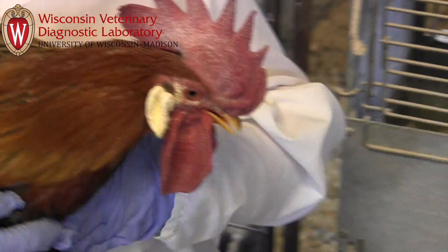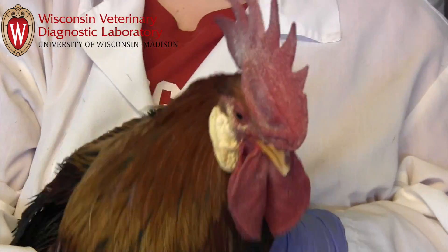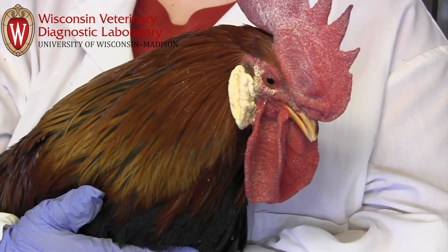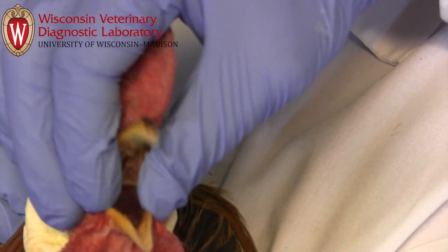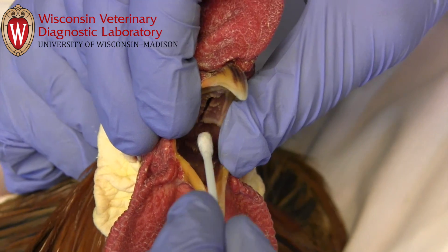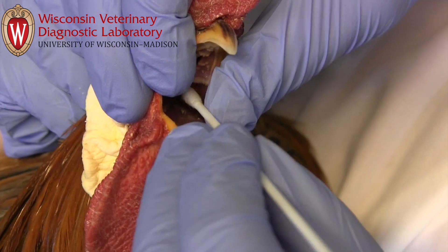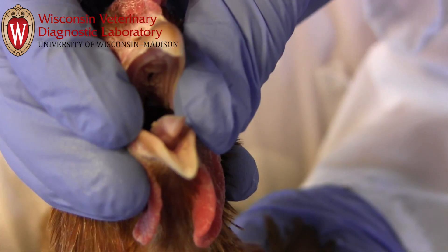Handle the birds confidently and calmly to prevent unnecessary stress. If the bird vigorously resists, give it a break while keeping it secure in the holder's arms until you attempt again. Open the mouth with gentle but firm pressure at the corners of the beak. Having a finger in the angle of the beak will keep the mouth open as you work. Gently extend the neck in order to get a better view of the oropharynx and the choana.